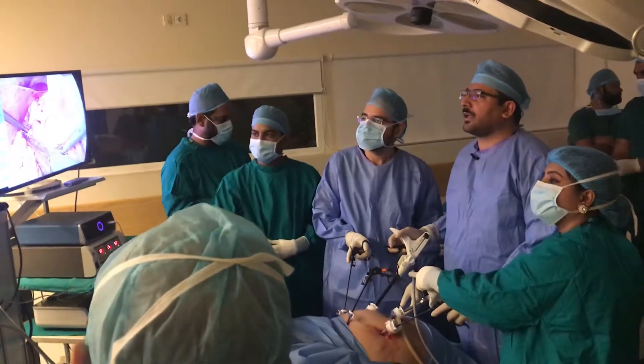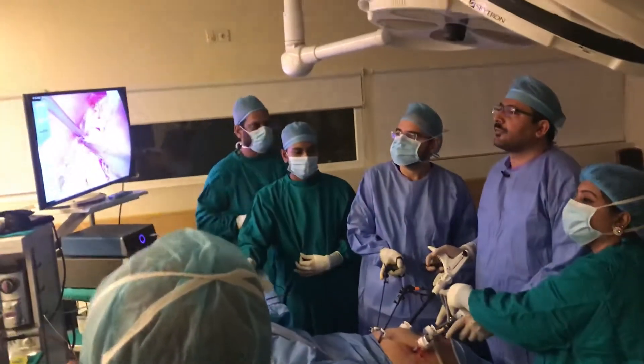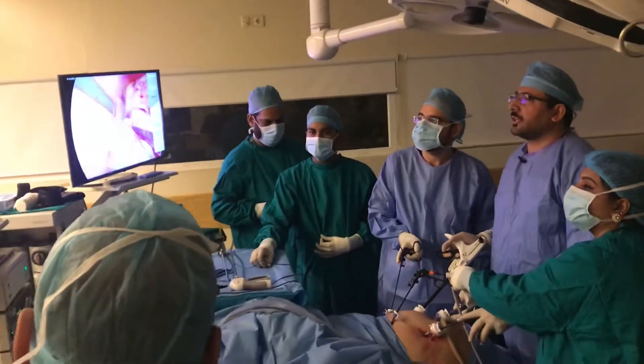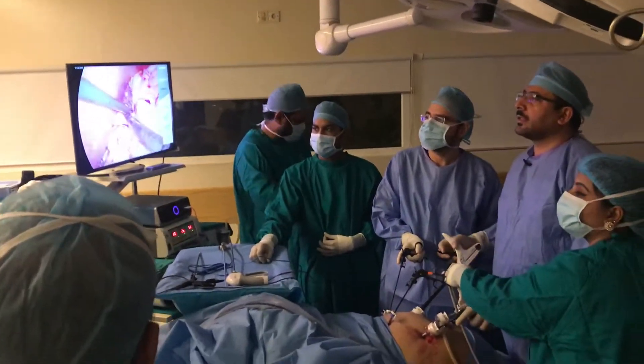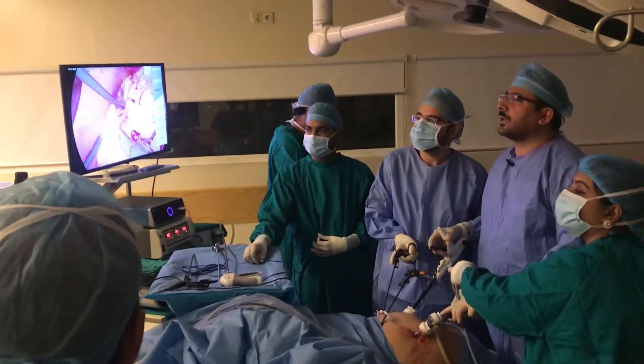Now you can see we have a wide and long pouch. That is the base of this surgery, because we don't want it narrow.